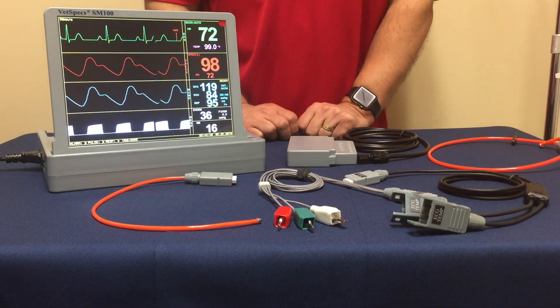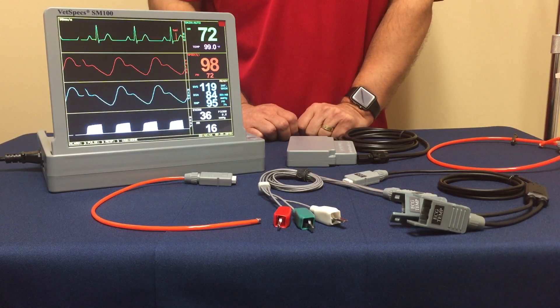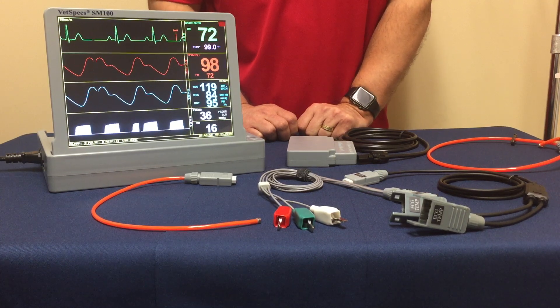Greetings. We're following through with our summary series for VetSpecs monitoring systems. Today we're going to be talking about the rectal temperature option that VetSpecs is now providing.